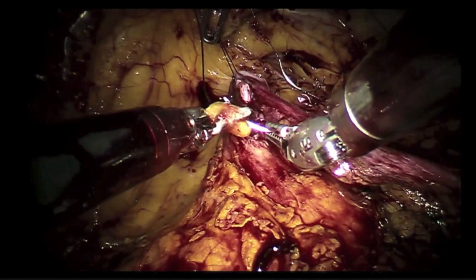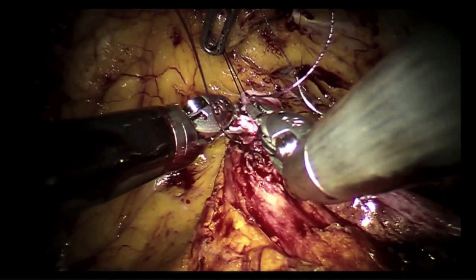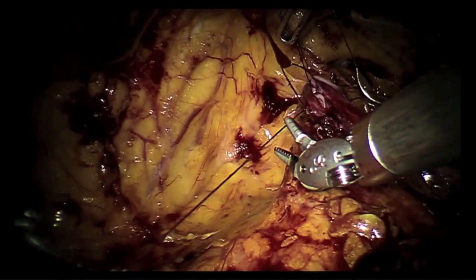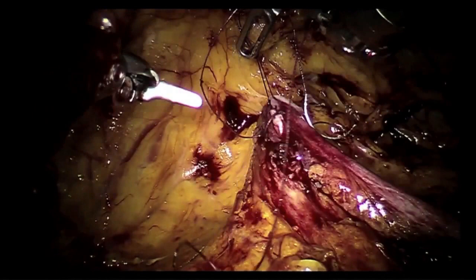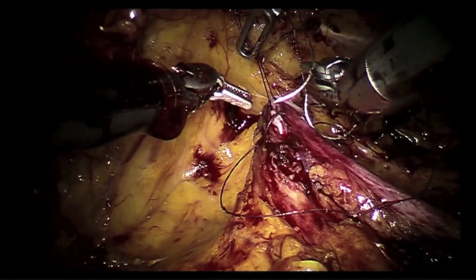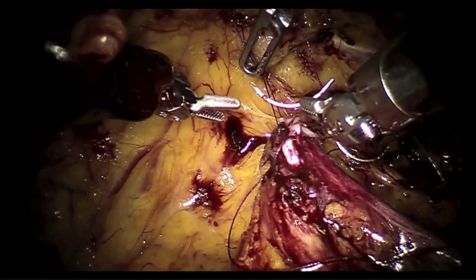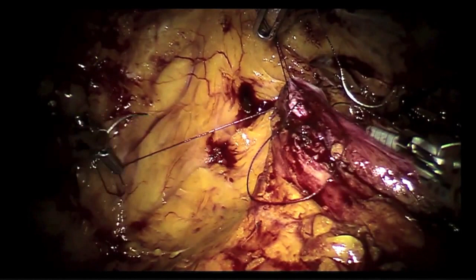Definitely. There's been a study of the compression of the learning curve for those people, and they divided surgeons into three categories. In the first category, there were surgeons experienced in robotics, not so much in transplantation. The second group were surgeons really experienced in both robotics and kidney transplants. And in the third group, there were surgeons experienced only in kidney transplant, with less than 10 cases of robotics. The worst results were in the last group. The final verdict was that it really didn't make a big difference, but the problems were mostly encountered in this group of surgeons.